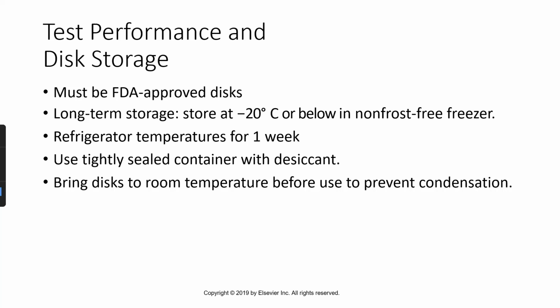Long-term storage: store at -20 or below. Refrigerate temperatures for 1 week. Use a tightly sealed container with desiccant and bring the disc to room temperature before use to prevent condensation. This is really important, especially when using discs that aren't used often in the clinical lab. You want to make sure that the discs you're putting on the plate are at room temperature, but you don't want them to be at room temperature for too long. So if you're not using them constantly, you've got to make sure to return them either to the fridge or freezer, wherever you got them from.